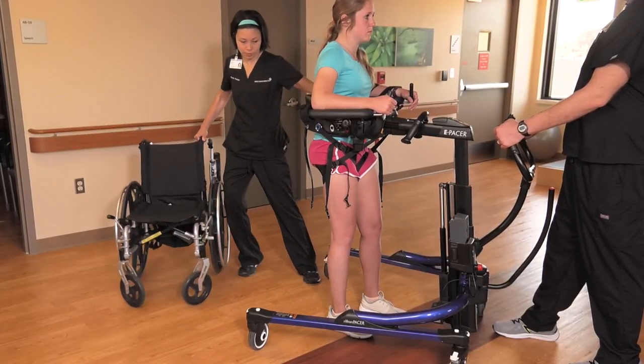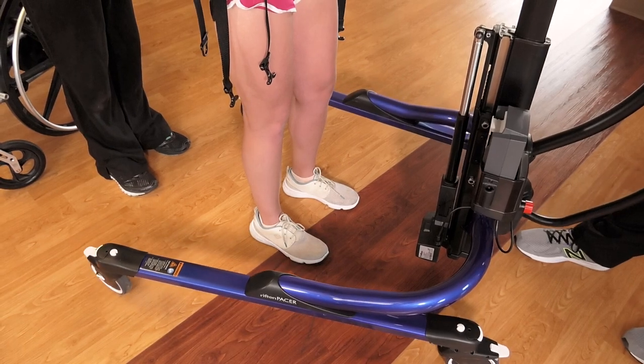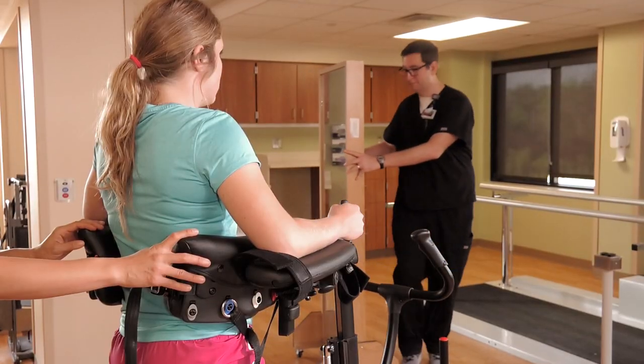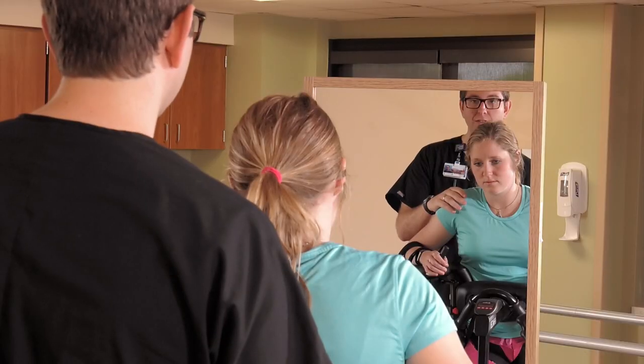Have the assistant pull the wheelchair back and out of the way. Use the expansion handle to bring the base legs close together and lock the rear casters. Have an assistant place a mirror in front of the patient.